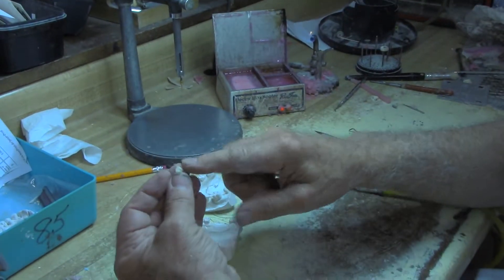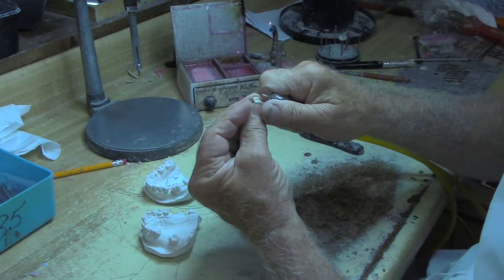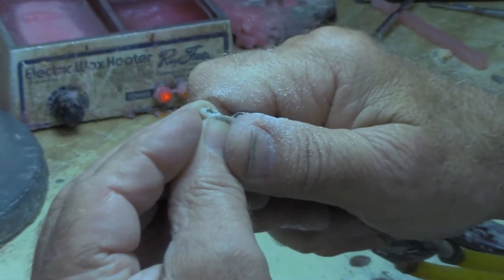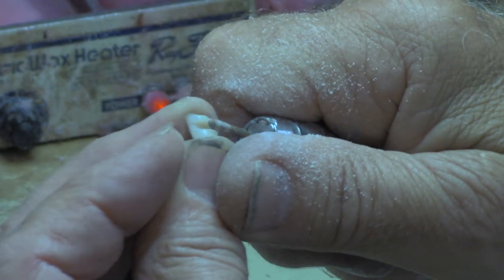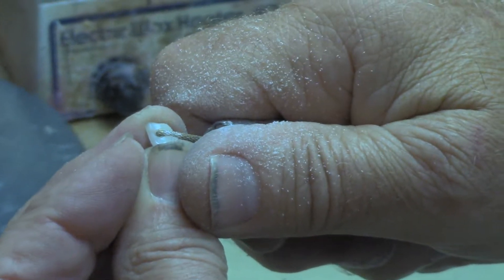What I'm going to do is cut a slot in this. I'm just going to take a straight burr and cut a straight slot right through it, almost all the way through — going through the top a little bit. That's going to be important later when you go to dupe it. So I cut that slot in there.